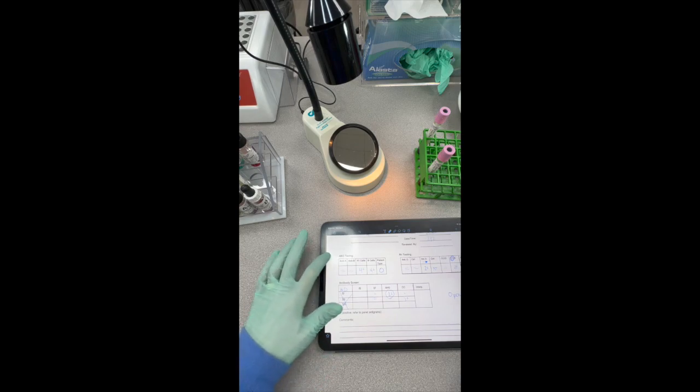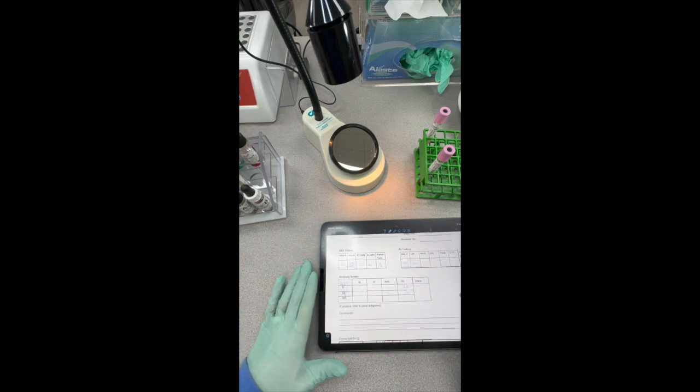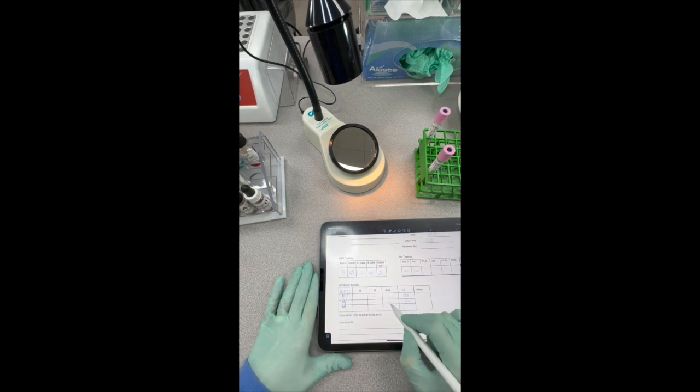Okay. Now we'll take a look at our other patient that we worked on. Let me pull that up. And there it is. It took a minute. So it had a true negative. Our weak D was negative. Our control was negative. And then our check cells came up there. So for this patient, our interpretation is negative, and they are a true A negative individual.